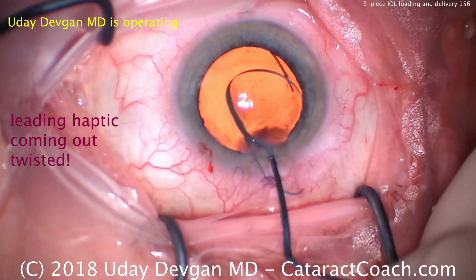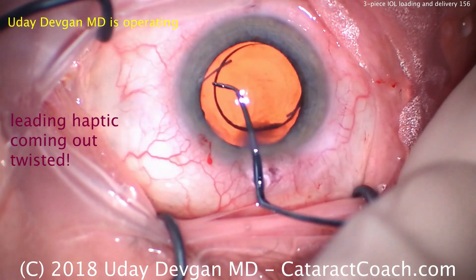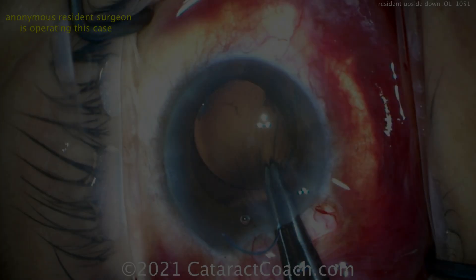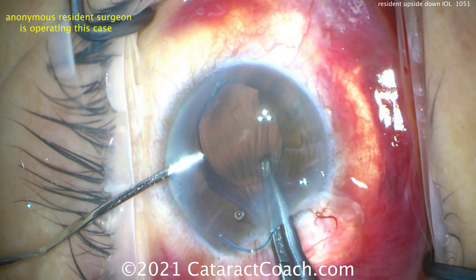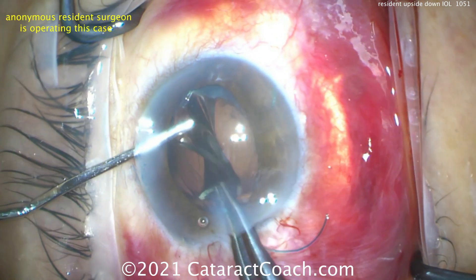Turn again to make sure that trailing haptic is now the capital letter L. So seven-L is that orientation — the overall haptic formation looks like the letter Z, and never like the letter S. S is for stupid mistake; the doctor's not stupid — the mistake is the issue. So we're going to flip it in the eye, holding it with forceps, putting a spatula in, and twisting that optic.